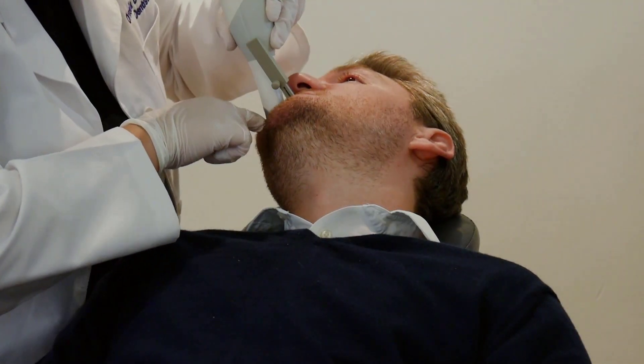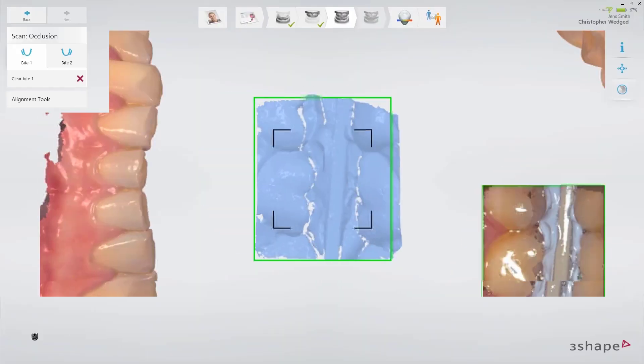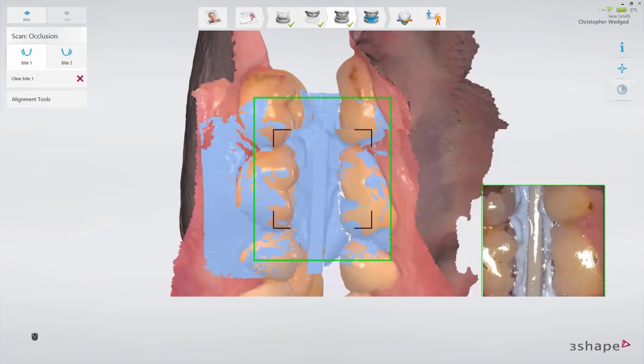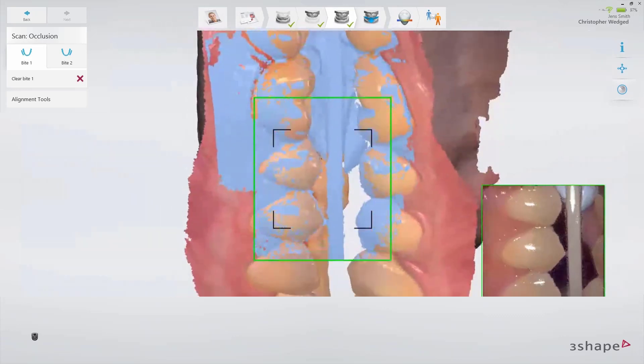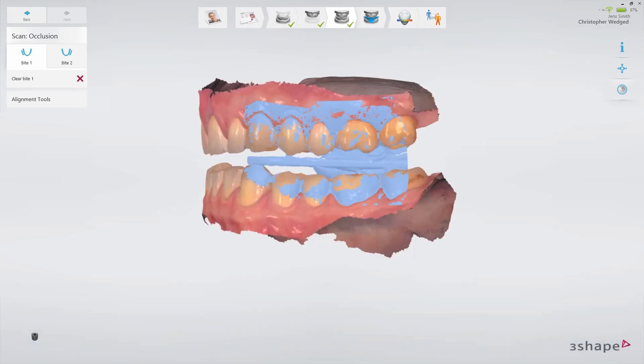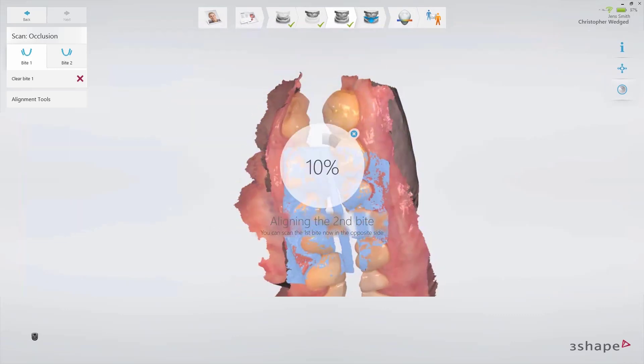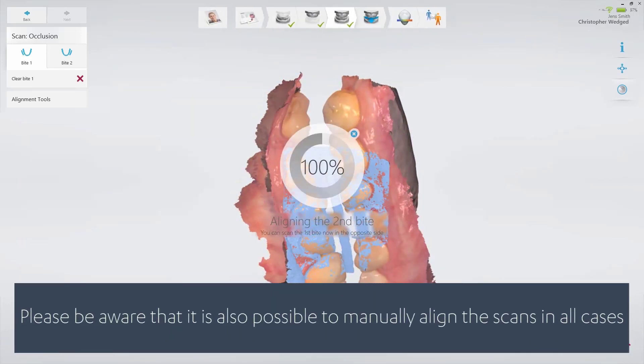Insert the scanner carefully in the mouth and drag it to the side that you wish to scan. Scan the bite following the official 3Shape Scan strategy. Try not to move the position of the inserted gauge. The scan should cover at least 3-4 teeth for a perfect alignment, even if the scans snapped together earlier. The bite registration should be done on both sides, and the bite will be aligned automatically.